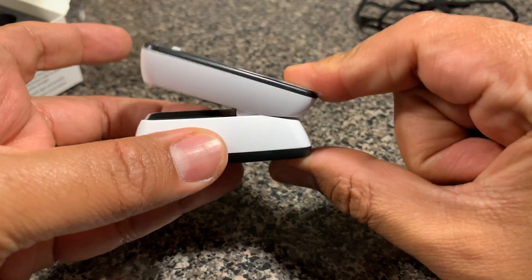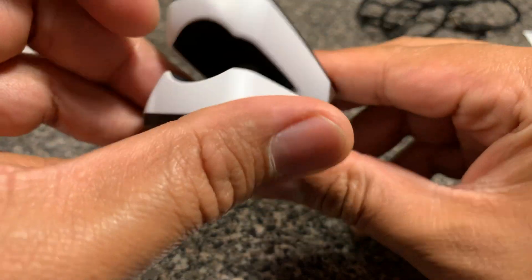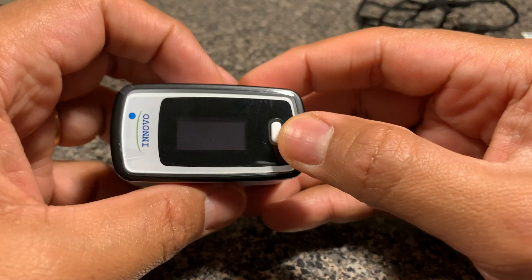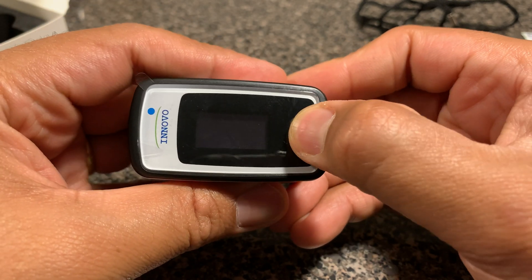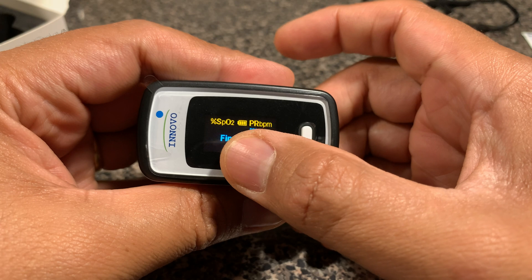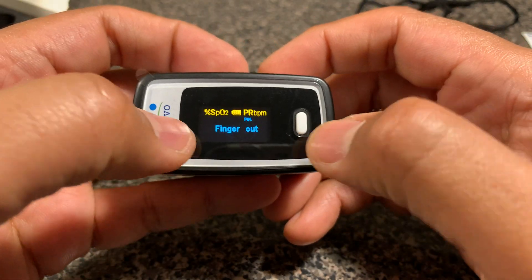It's a clip-type function, so all you do is press here and slide your finger in to take a read. There's a foam-type soft material inside. Now that the batteries are in, if I click this button it shows that the finger is out — obviously nothing is inside. It shows how much battery is left, and the screen turns off very quickly, about three seconds after activation, displaying SpO2.